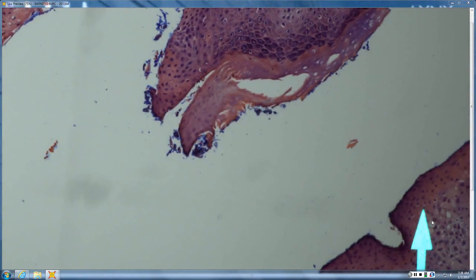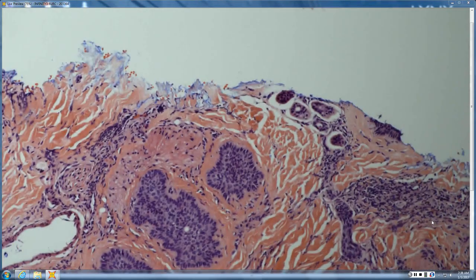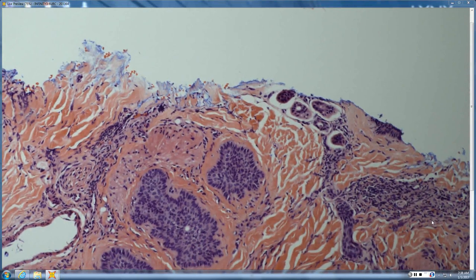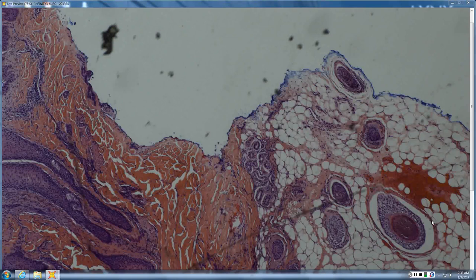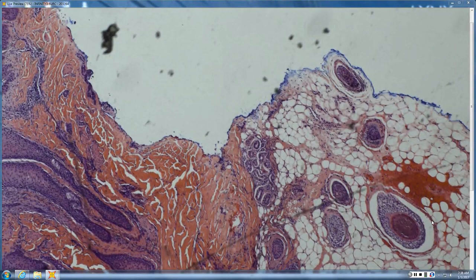See that whole dead red zone up above? So this is something that's been picked at a lot. With prurigo and excoriation, you can get a lot of conversion to catagen. It's almost like trichotil, where you just keep going after and pulling that hair. So I see a lot of secondary change. I'm not sure I'm seeing a lot of primary change here.